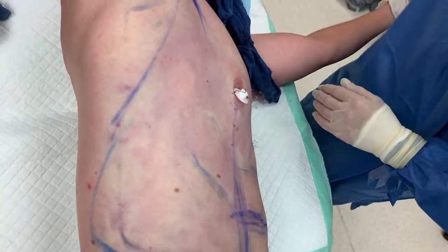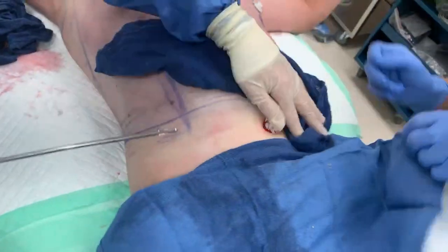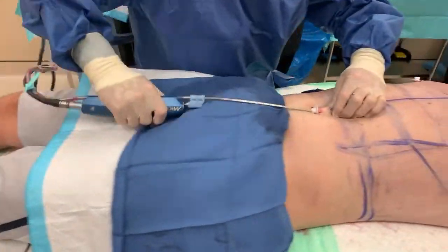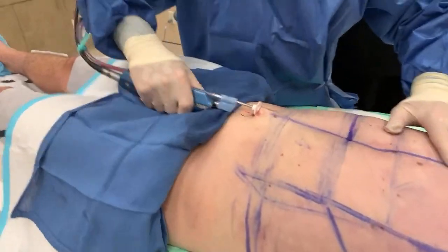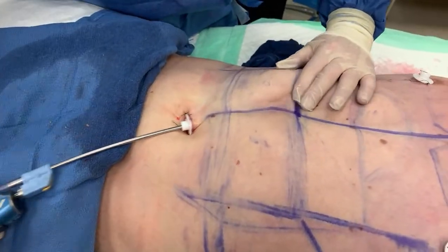Good — I like that. Come on back down, slide on his back. Good, perfect. I haven't done this yet — just a little more over here. We have a good amount of people on here today. We're on YouTube live.